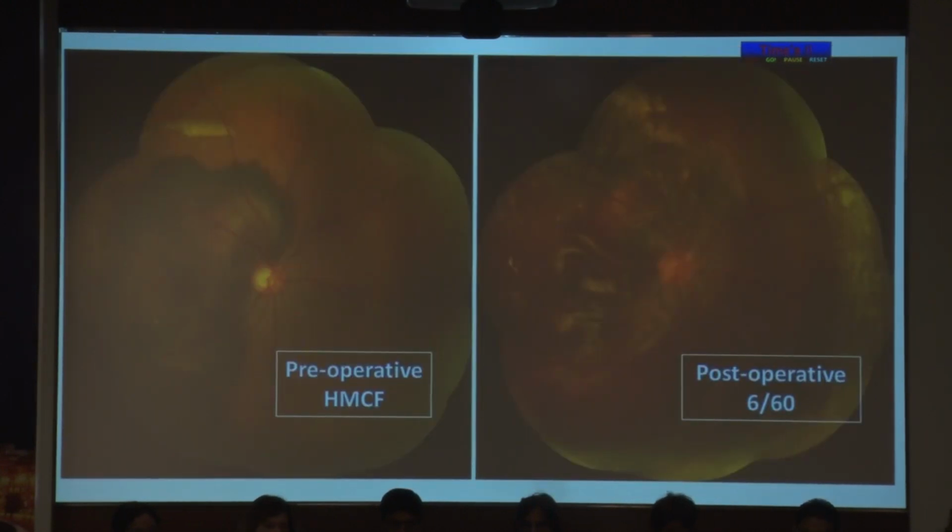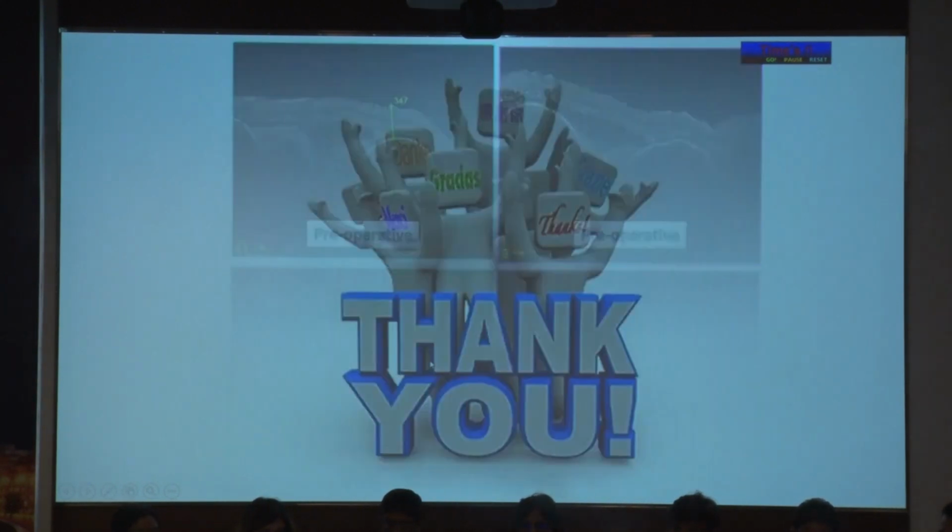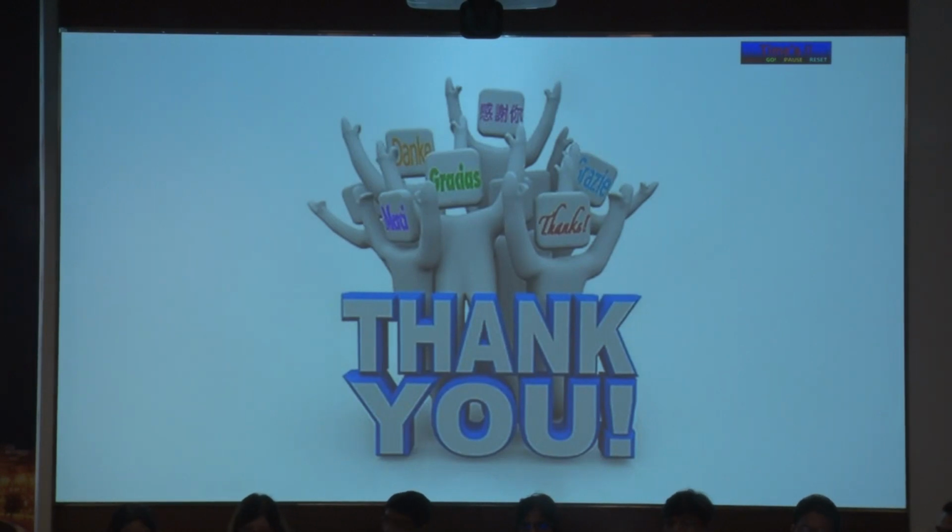In the post-operative period, at the 14-day visit, the vision had improved to 6/60 from hand movement. What we see is that the subretinal hematoma has gone, and even the sub-RPE hematoma is resolving. Thank you very much.